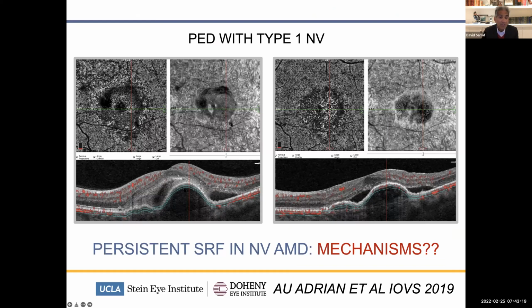In this case, we can again see a pigment epithelial detachment, subretinal fluid, subretinal hyperreflective material, indicators that this patient has an active exudative focus due to a neovascular membrane that we can see here on OCT angiography. We went ahead and injected this patient with a series of Eylea injections. And in this case, there's resolution of the SHRM, improvement of the fluid, but some persistent fluid, indicating that perhaps we have persistent neovascular activity that you can appreciate again here on the OCT angiogram, these fine vessels that are noted with en face OCTA.